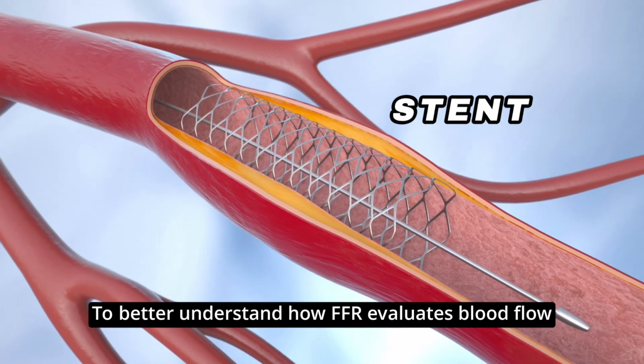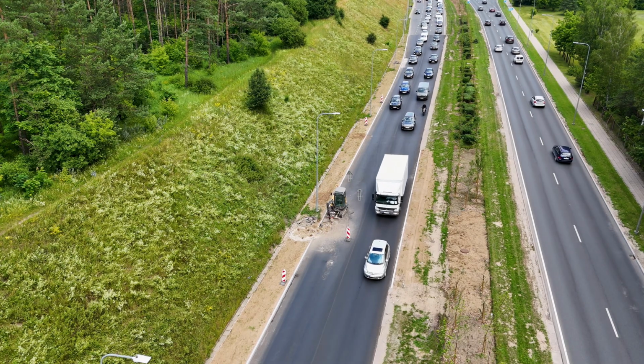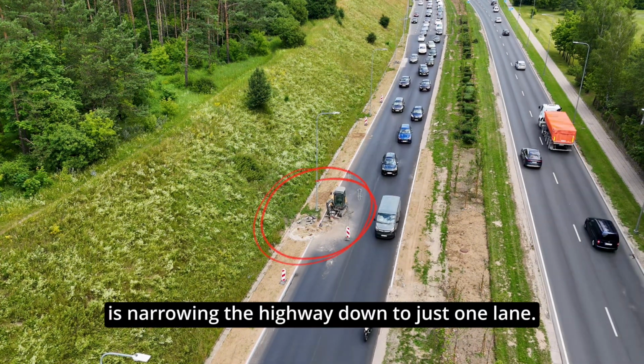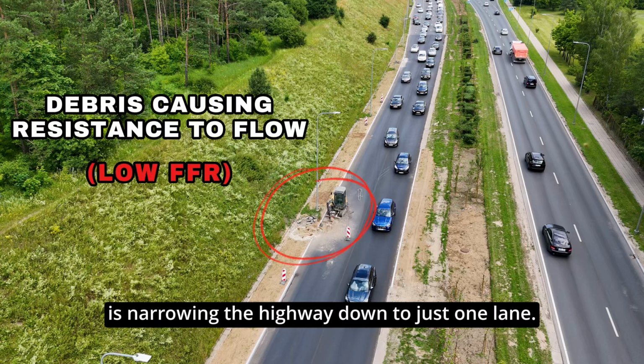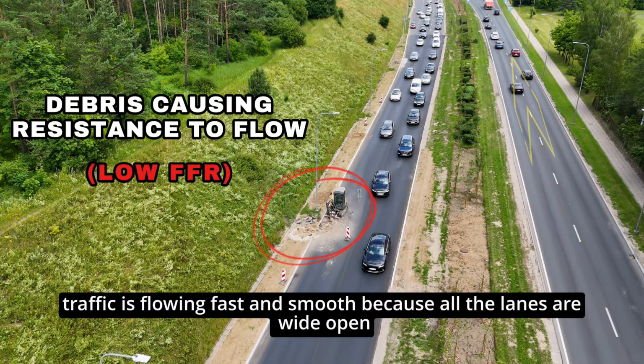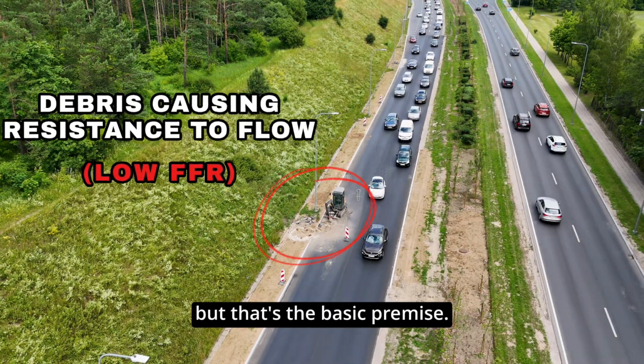To better understand how FFR evaluates blood flow, think of traffic on a highway. On the left, all those cars are slowing down because the debris on the side of the road is narrowing the highway down to just one lane. On the right, traffic is flowing fast and smooth because all the lanes are wide open. Now, there are definitely more nuances to FFR, but that's the basic premise.